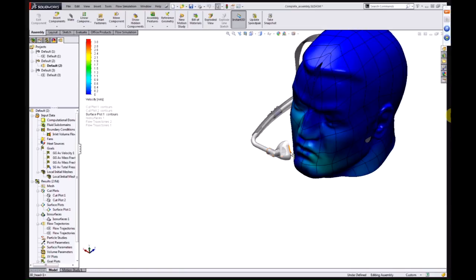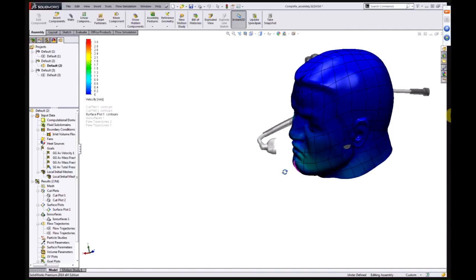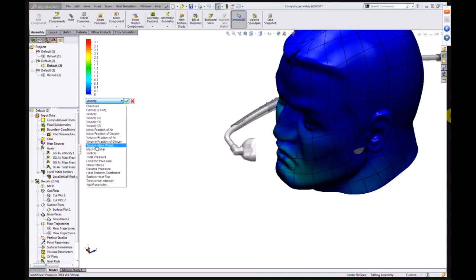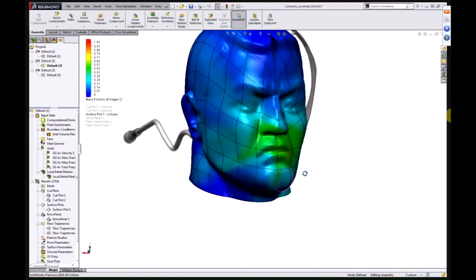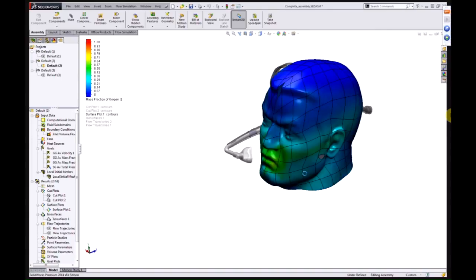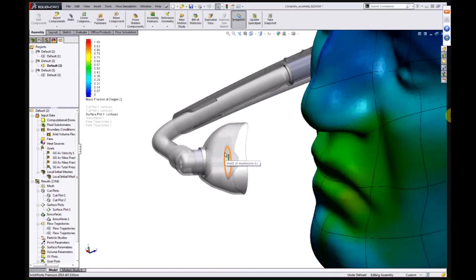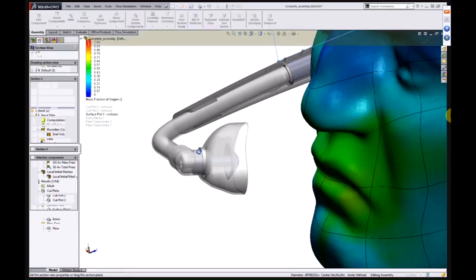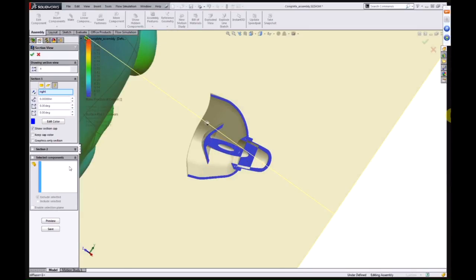The variety of things we can interrogate here. But we also have some design parameters available to us, particularly around the design of this little mushroom valve through here. Okay, we can adjust the angle of these arms, we can adjust the spacing, and because we're inside of SOLIDWORKS, there's nothing stopping us from finding the geometry we want to look at, double-clicking, identifying the dimensions, and changing them. As soon as we change something, it's ready to be analyzed, because we're completely in sync with our CAD model. We would just change this value and hit solve.